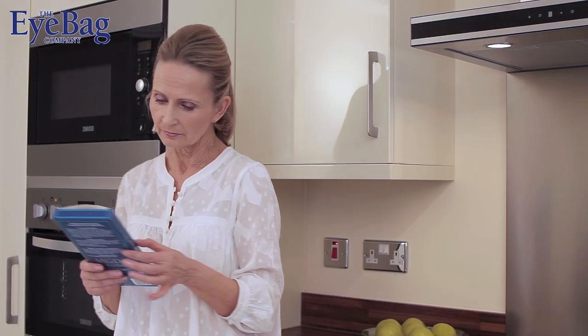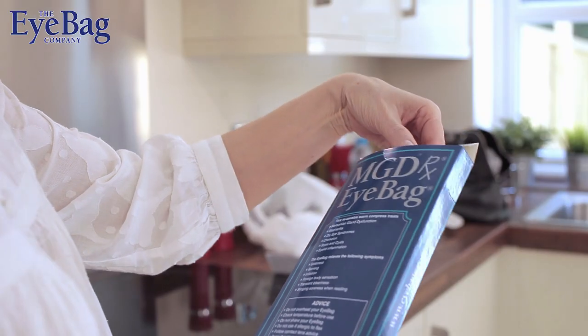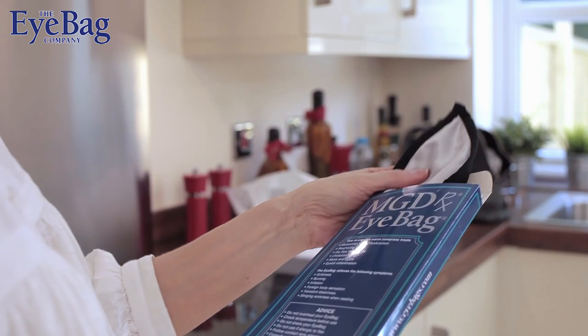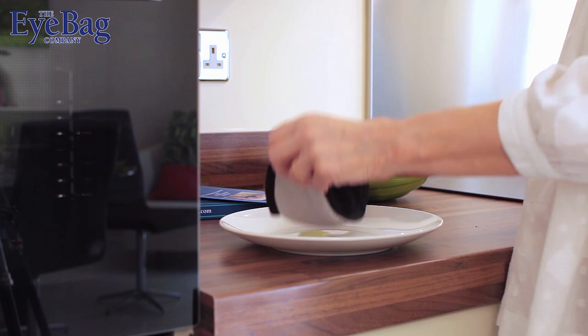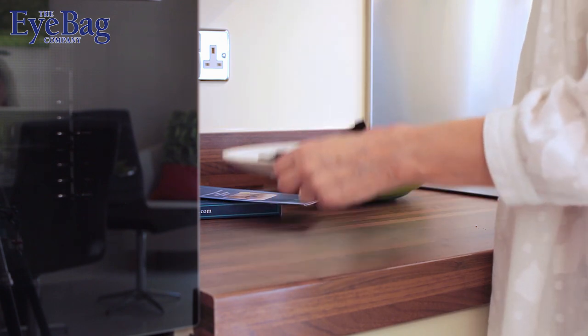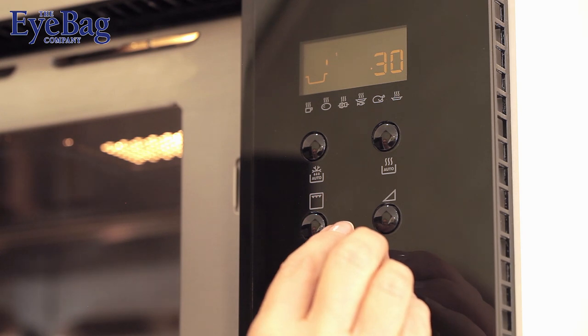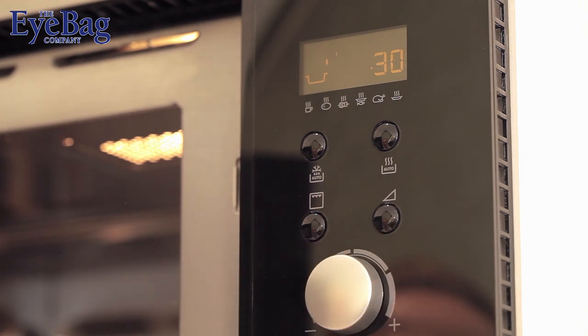You'll need a microwave and somewhere comfortable to relax your head. Your eye bag comes in a handy box that you can use to store it in between usage. Put the eye bag on a clean microwavable dish in the microwave oven on full power for 30 seconds. If you're using a 650 watt oven you may need to keep it in for 40 seconds.